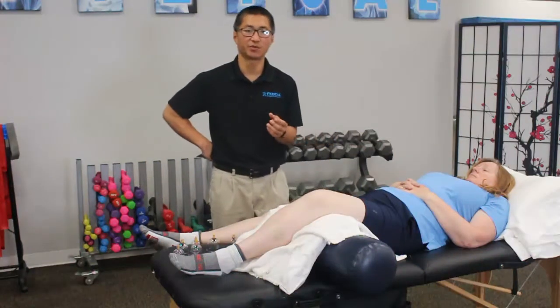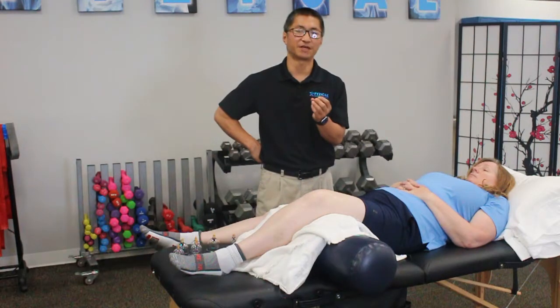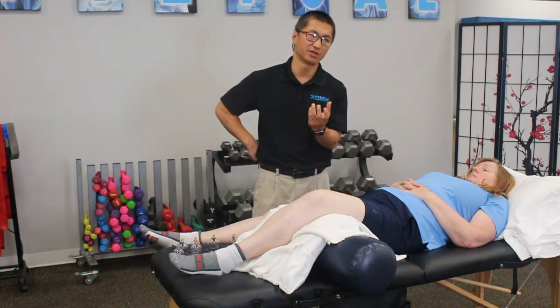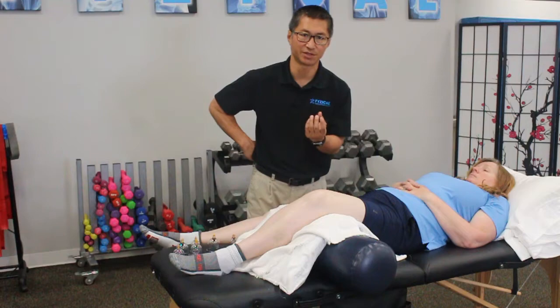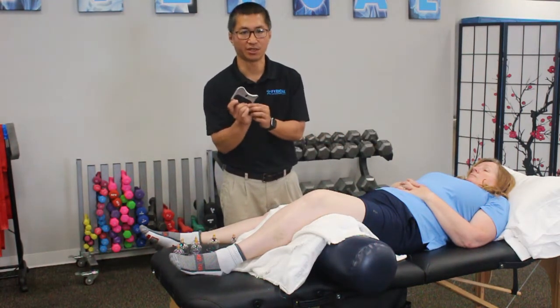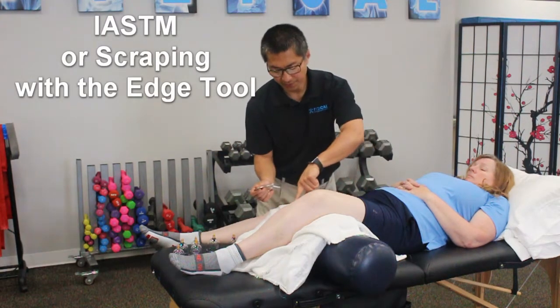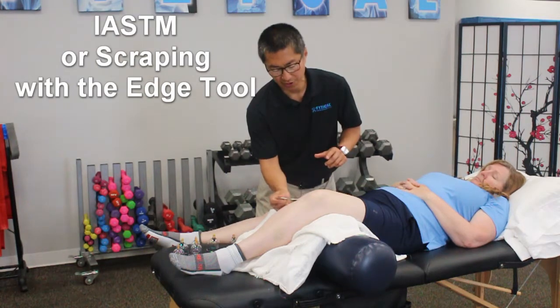So one of the first things we want to do is work on the fascial system, because when you injure yourself, the fascial system gets tight and kind of dehydrates and adheres or gets stuck to the tissues around it. So one of the first things we use is a scraping tool, and we use the edge tool, and I'm going to focus some treatment along the medial collateral ligament here itself.